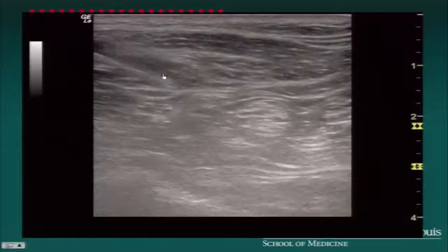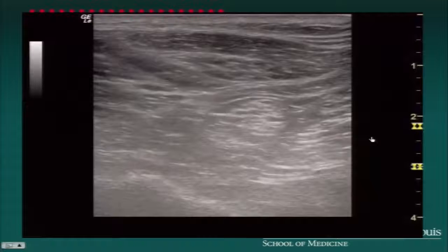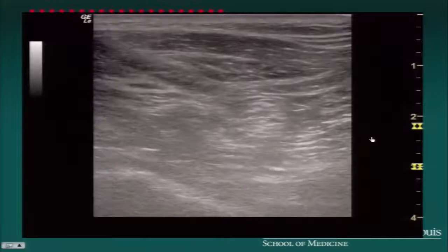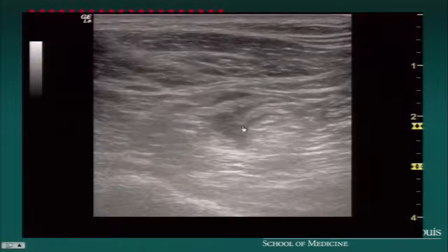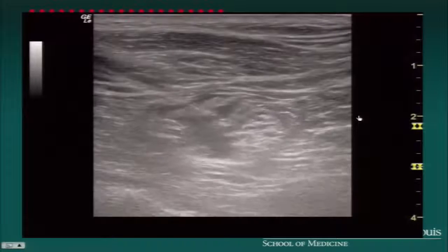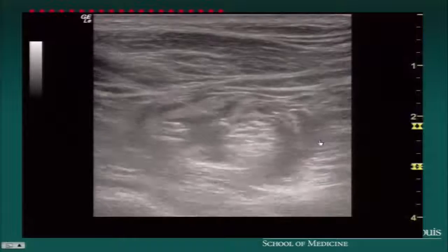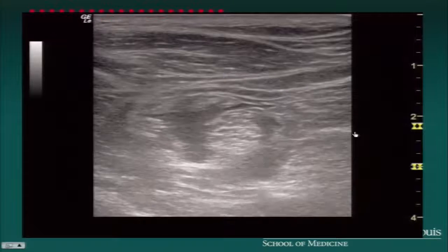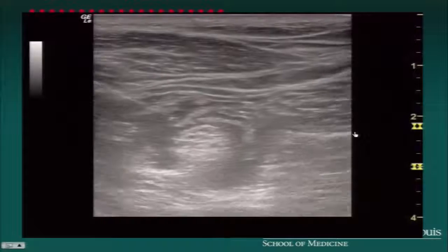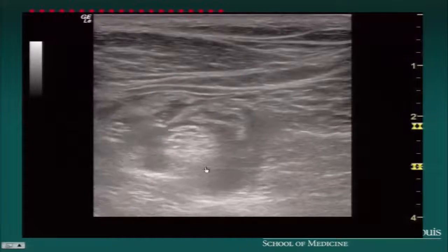Here comes the needle. Invariably, you're going to end up going through the biceps femoris, which is okay. Classically, you try to get in between the iliotibial band and biceps femoris. Again, this is pretty difficult with surface anatomy to surmise that. Now we're injecting local anesthetic around this nerve, and you're seeing a nice start of a halo pattern around here. Again, repositioning. There's a decent amount of pressure. There's the nice halo effect around this nerve, and you can see that this entire nerve has been completely surrounded with local anesthetic. Again, we try to put this catheter somewhere where it's trying to bathe both components of the nerve.